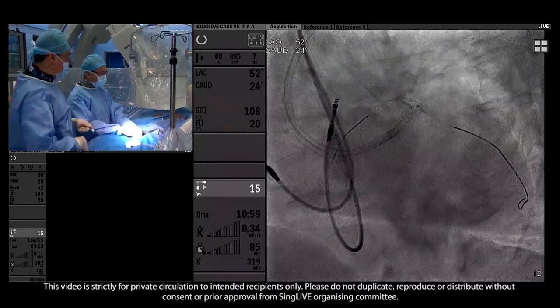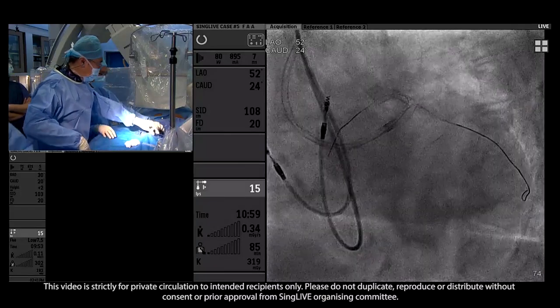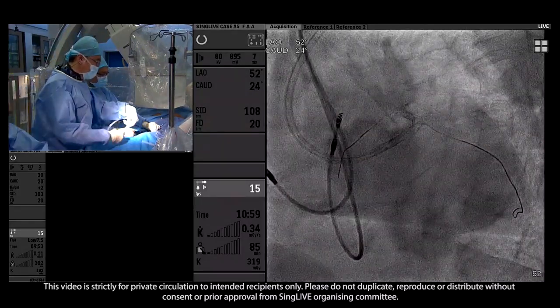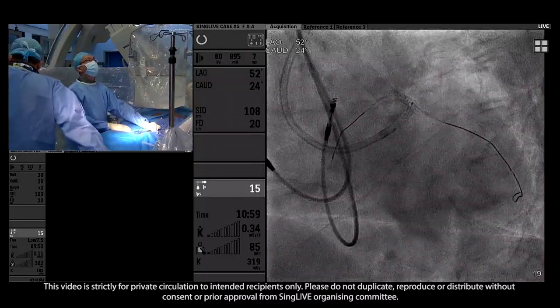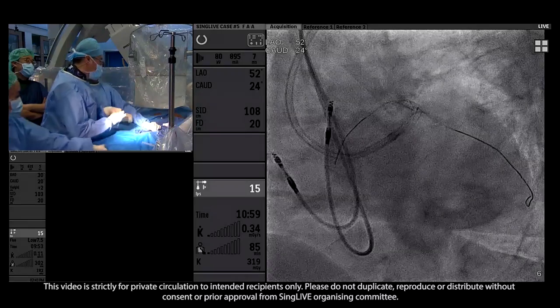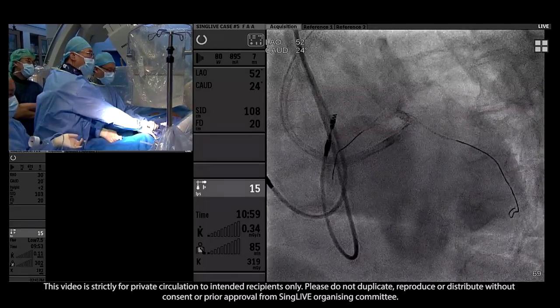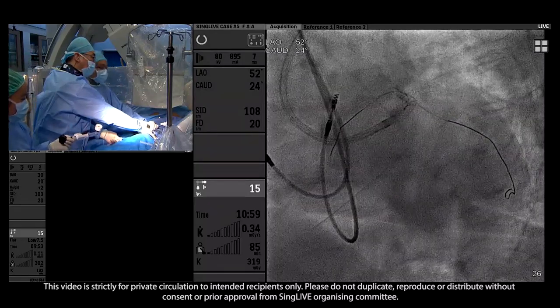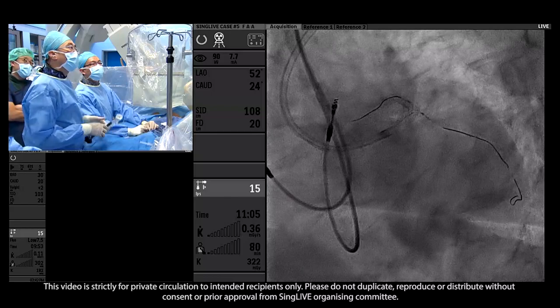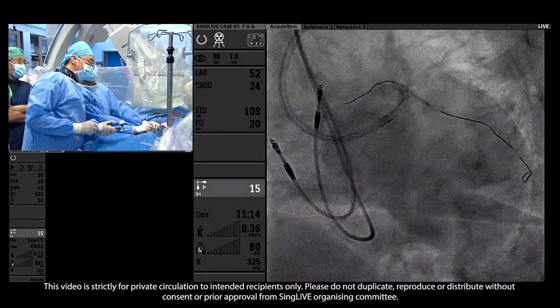The other option is to post-dilate the stent a little bit more. We've used a 4.0 short balloon, and went high at the carina to optimize the rewiring. So you're planning to do a kissing TAP at the end? Initially it was TAP, but looking at the angiogram, would anybody suggest maybe FFR and drug-eluting balloon to finish? Yep, agreed. But this is a very complex distal true bifurcation region, and we cannot ensure a good result just using balloon angioplasty. If you do a drug-eluting balloon or an NC balloon, there could be some severe dissection and narrowing of the LCX ostium. I think restenosis is very common. So for such a complex region, I would require an upfront two-stent technique, which would be better.